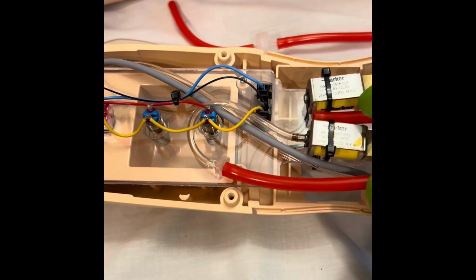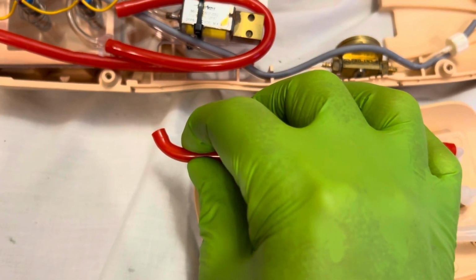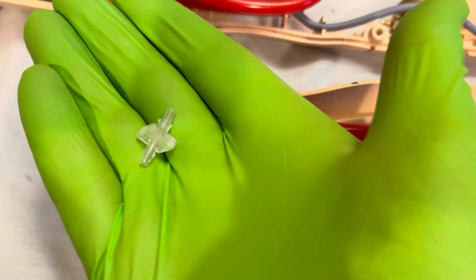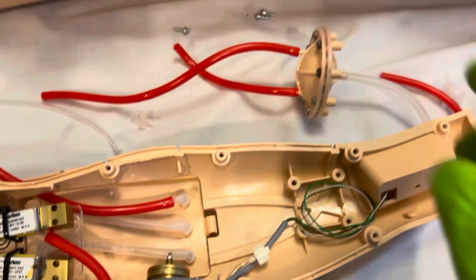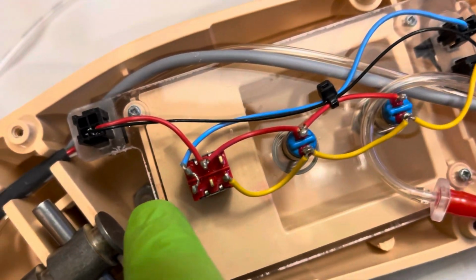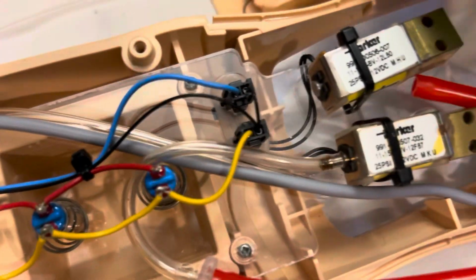I'm just going to tuck a couple of these hoses out of the way. Anyways, I'm going to cut out this end here so it's a little more straight and not curved, so we can attach our fitting and the hose that we bought. Or you can reuse the one that you have. Next, we're going to reuse the longest hose off this bell to connect to the entrance port there, and then back to the IV pad, the top part of the IV pad.